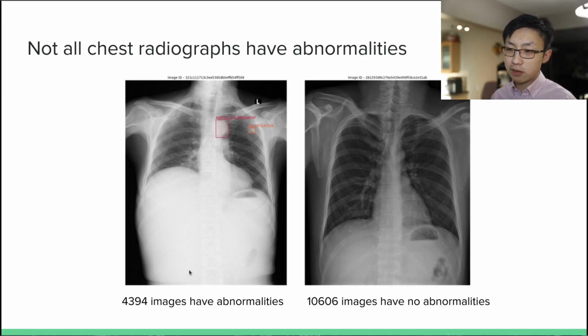Instead of feeding chest radiographs directly to our object detector model, we first use a 2-class classifier filtering model. For this paper, we use 2 model architectures that are the de facto standard for classification, which are ResNet, specifically ResNet 50, and EfficientNet, which are previous state-of-the-art models and extremely fast. The classifiers are trained on 2 classes only: chest radiographs containing 1 or more abnormalities, and chest radiographs with no abnormality. Other findings and abnormality labels are dropped. This model solely differentiates which images to pass on to the object detector models.